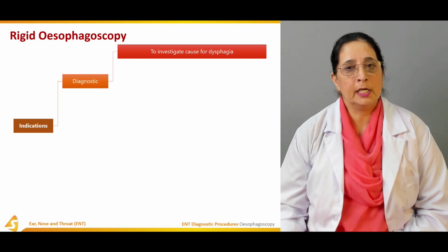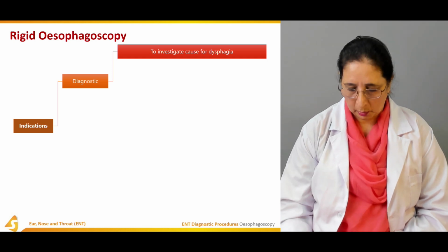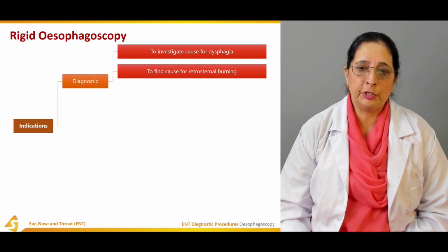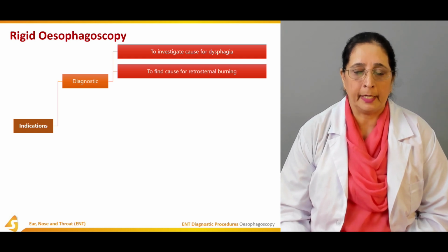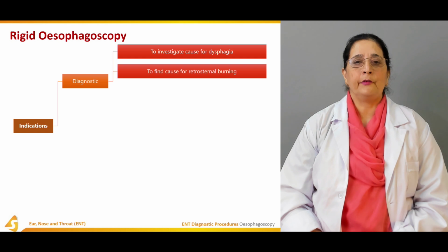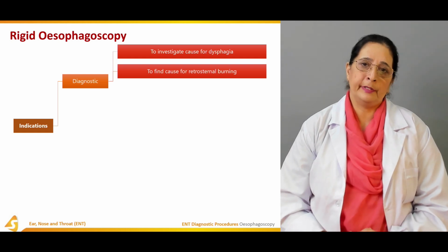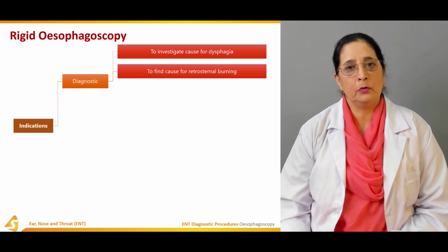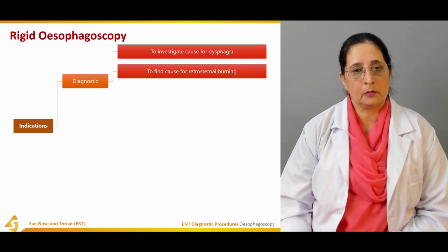Also to find the cause of retrosternal burning, which needs to be diagnosed by esophagoscopy.